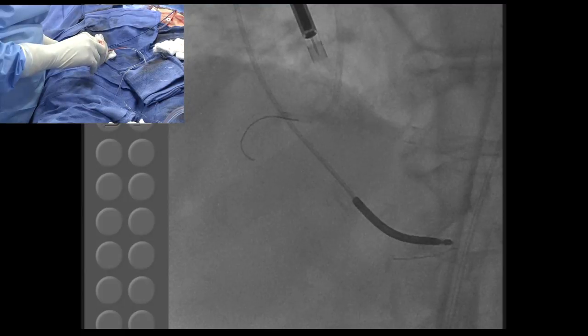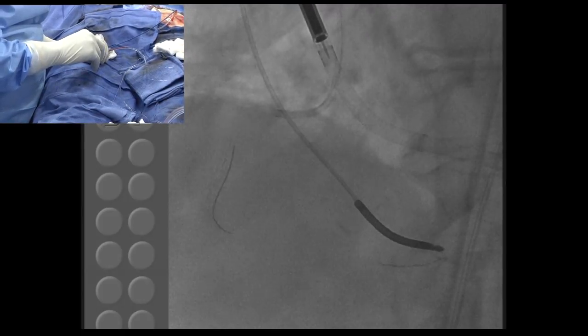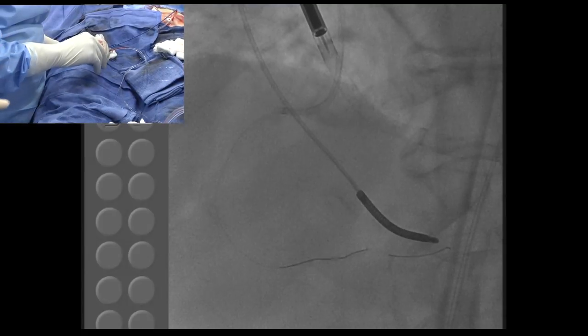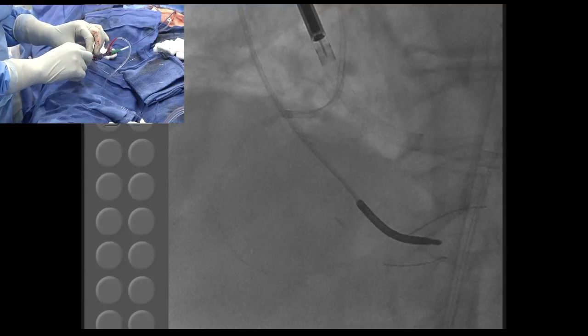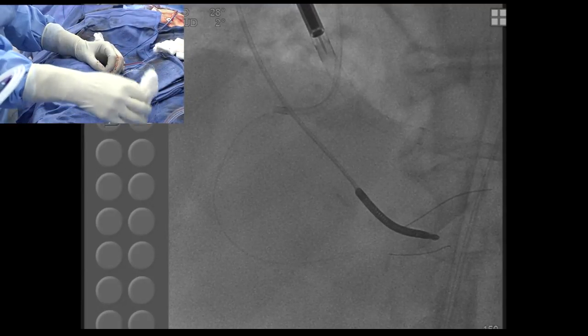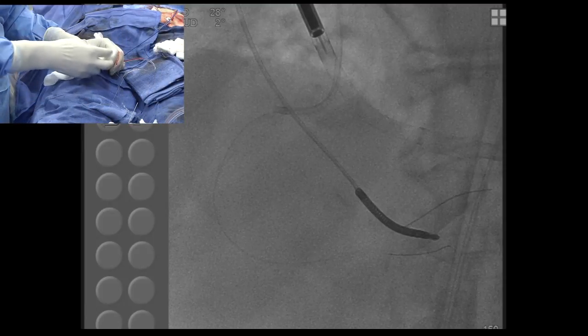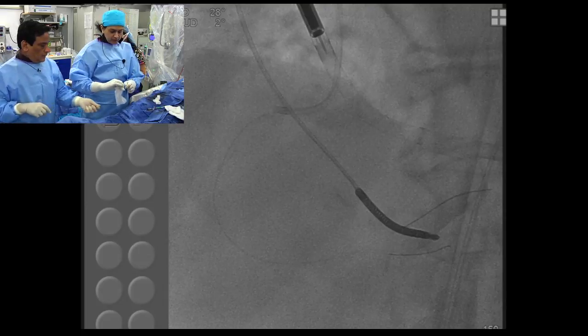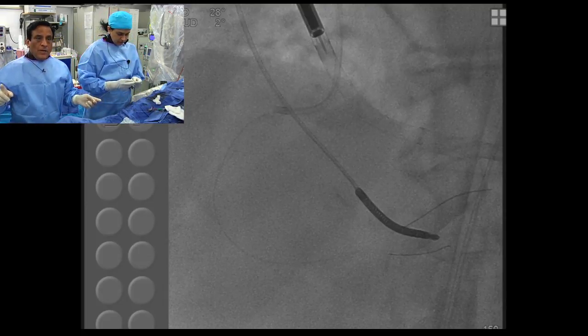So clearly we will increase the speed only if you cannot cross the lesion, and see the wire and everything goes very easy. Absolutely excellent demonstration. I know the hesitation you were having, and many people would have given up there as the lesion was confronting. Good. And second point, people will say, well, you already have a 1.5 burr.